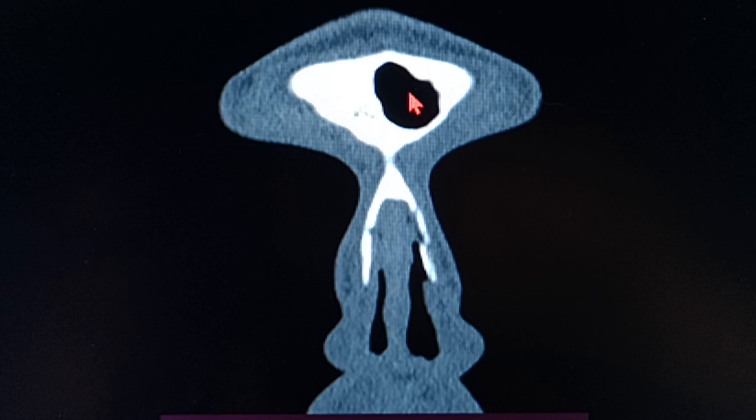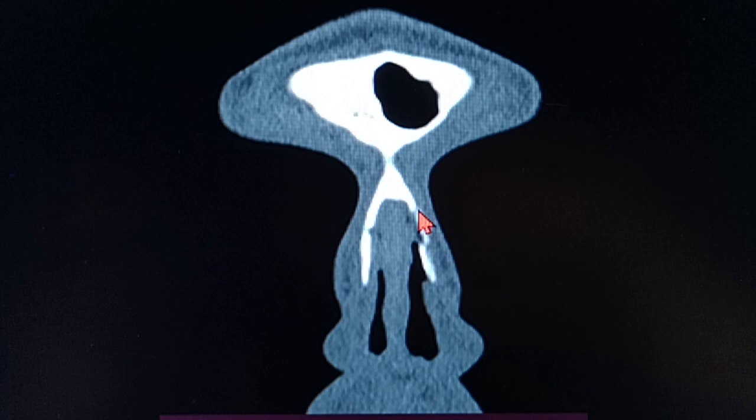Okay, this should ideally be the left frontal sinus, but so far we do not have any confirmation of the right frontal sinus. You can actually see this patient has a nasal bone fracture along with the frontal process of the maxilla. So you can actually see there's a minimally displaced fracture over here. So you can have that as well, for your knowledge.